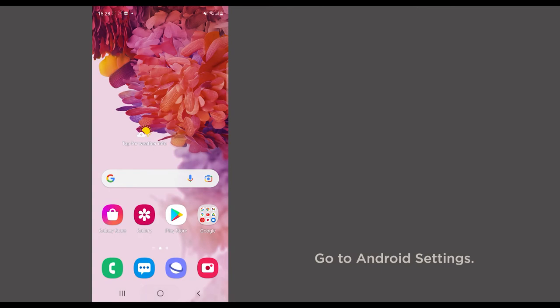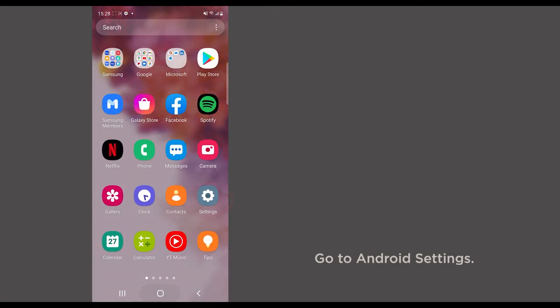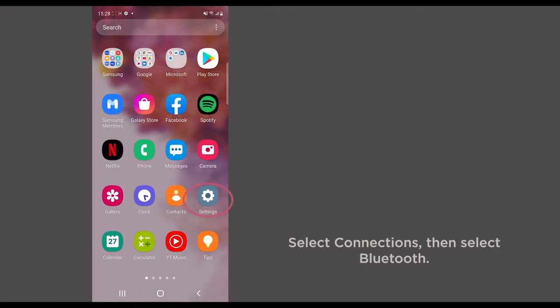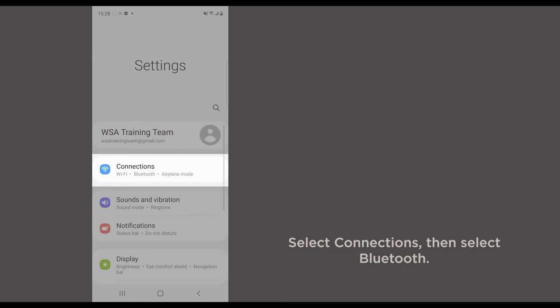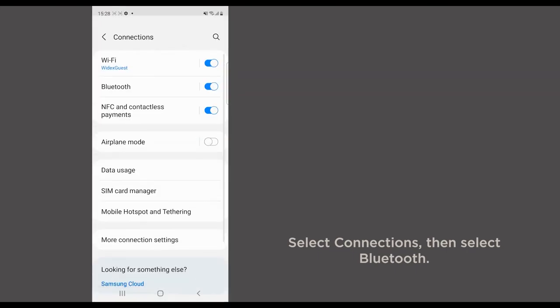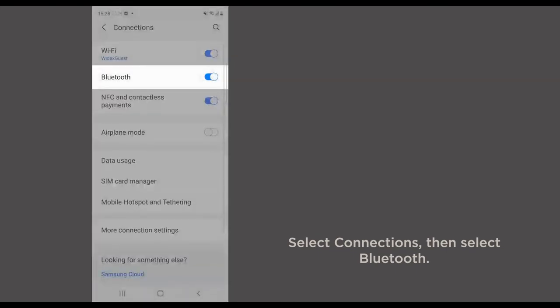Go to Android Settings. Select Connections. Then select Bluetooth.